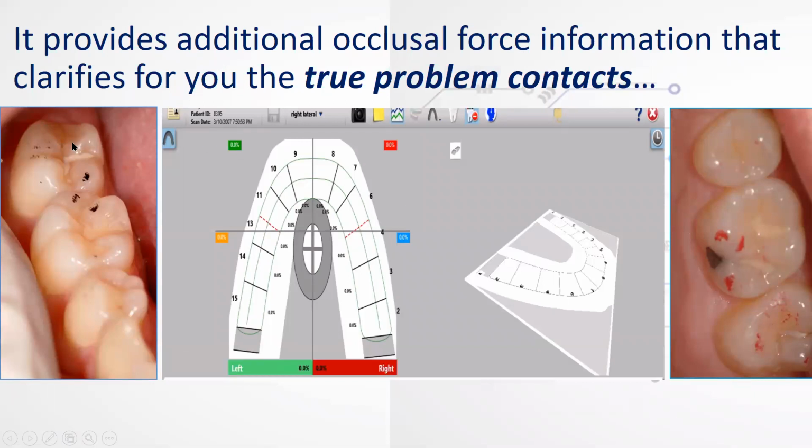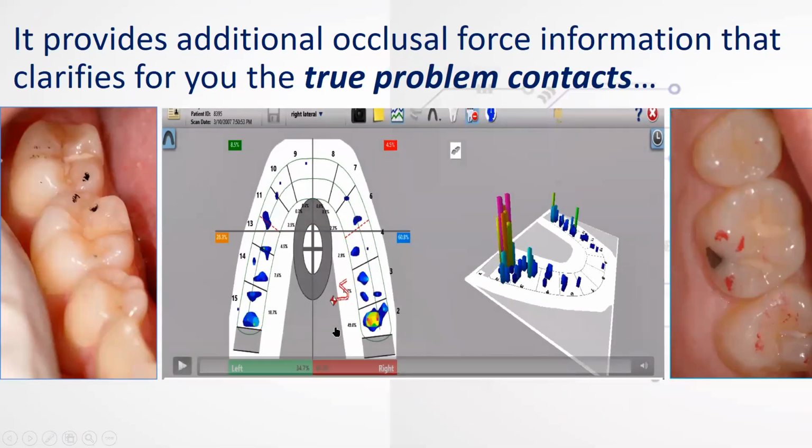The counterpart second molar also has exposed dentin, and there are no paper marks there, but there are some peripheral to the extreme loss of tooth structure. And then again, you have 3 large paper marks and extremely healthy tooth structure. So what's really going on here? Well, it's very unclear in traditional occlusal indicator methodology, but the T-scan clarifies it extremely well. There's a very high force overload. The second molars are taking 50% of the total force of the occlusion.